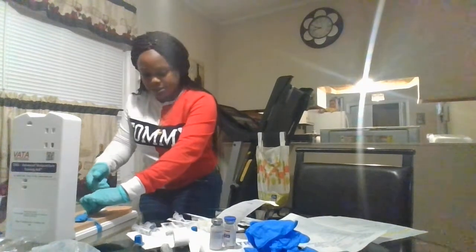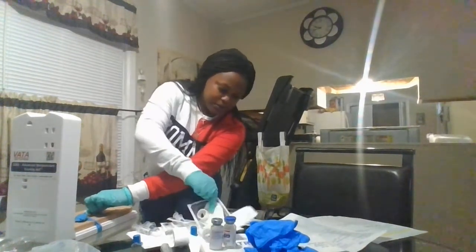Okay, at this time, I'm going to apply my Tegaderm.